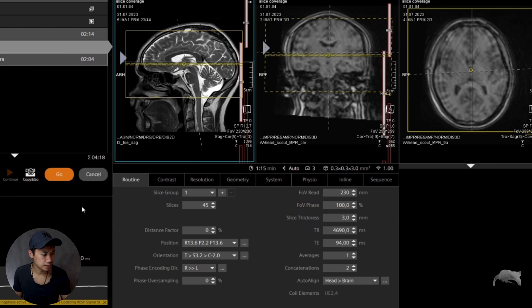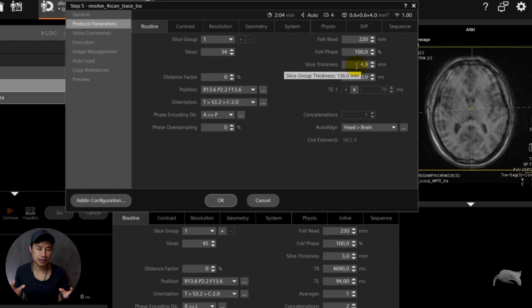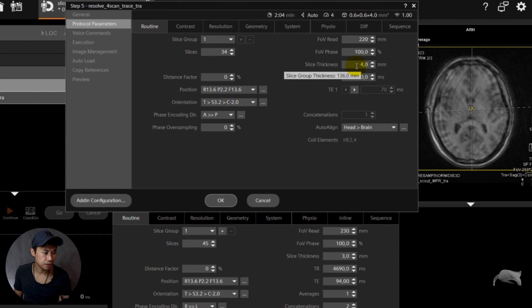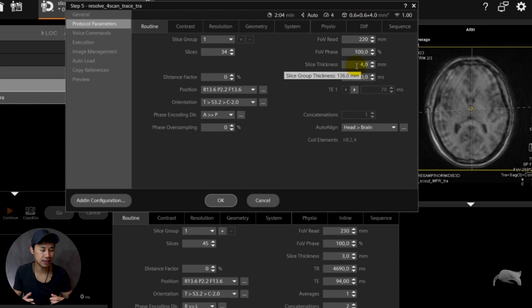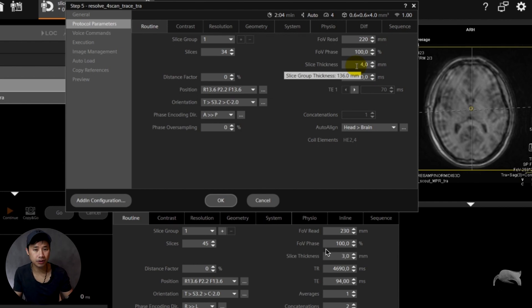Let's open the diffusion again so we can compare head to head. This is the diffusion: 34 slices, 4 millimeter — hover over that. Earlier I said it was 135 millimeters, right now it's 136 — it's almost the same. You can do a little modification with the distance factor just to get the same coverage. You cannot just use the diffusion with 45 slices because at 4 millimeters it would cover much more and you'd waste a lot of scan time. So 34 slices at 4 millimeter is the same coverage as 45 slices at 3 millimeter on the T2.